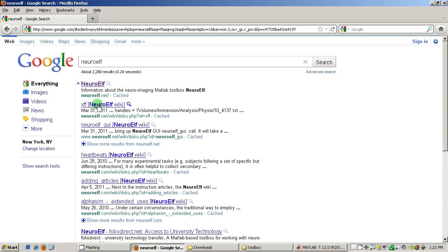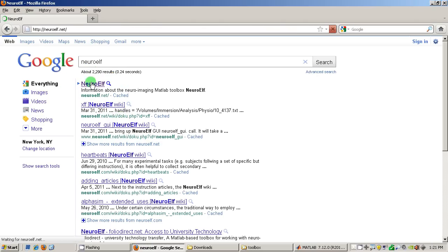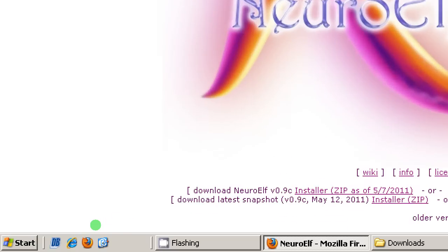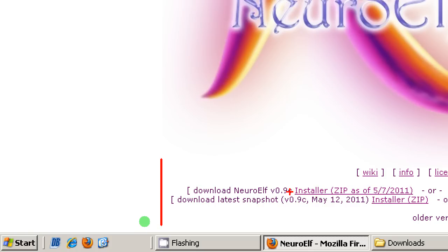Okay, I'm clicking on this link which opens the website and the current version is version 0.9c and as you can see there are two download links. One is for what I would call a stable version and maybe you want to use this, but today I'm going to use what I call the latest snapshot which also contains the latest features and developments.